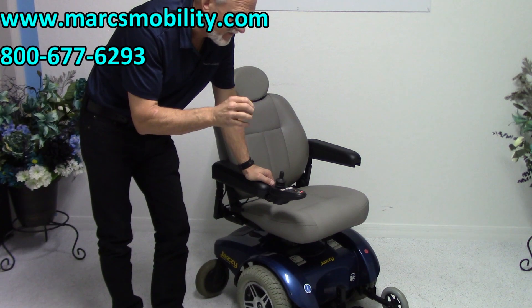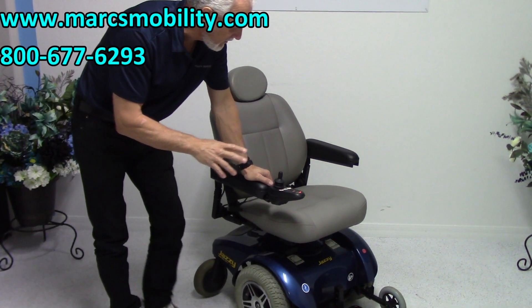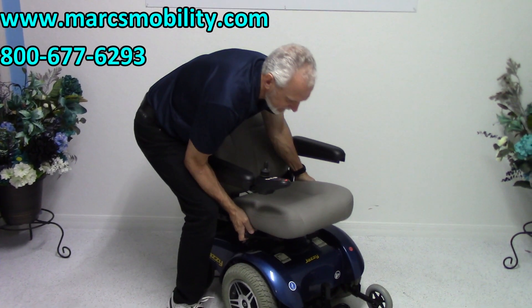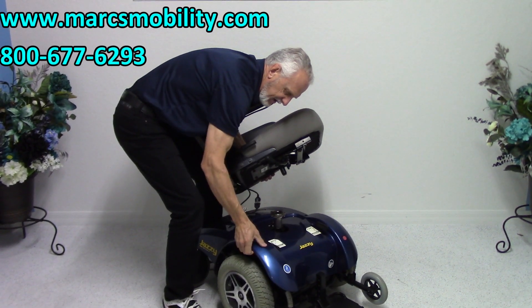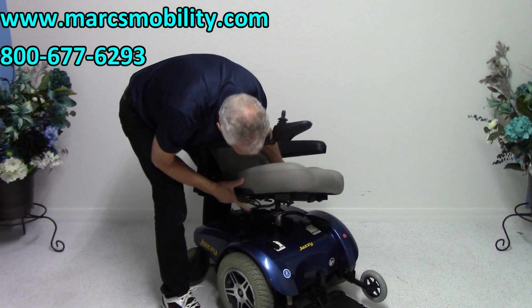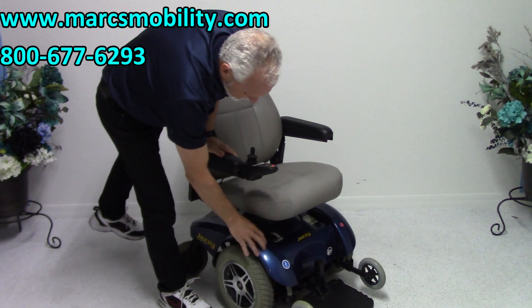It takes two 55-amp batteries. To access them, you take the seat off by moving the handle sideways and popping the seat off. Then put the handles in neutral, take the cover off, and the batteries are right underneath. That's how you get to the batteries sitting under that cover.